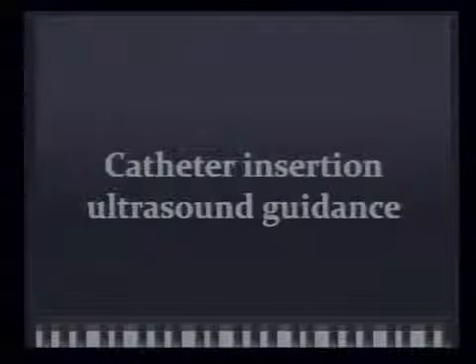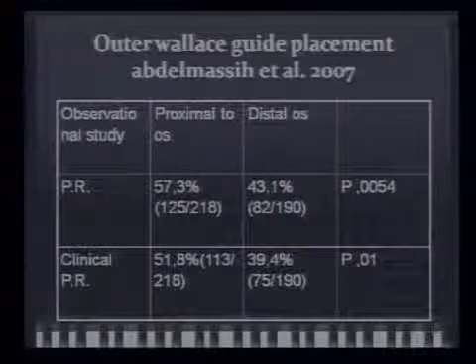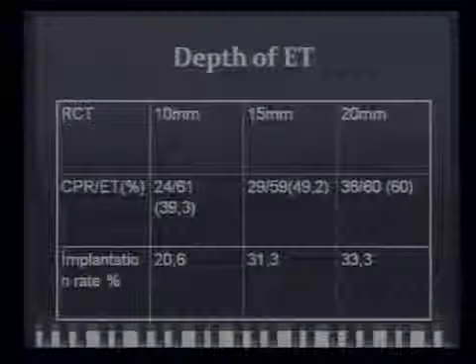What about the catheter insertion with ultrasound guidance? It has been discussed a lot. So as we know, ultrasound guidance positively affects the embryo transfer rates. Bladder filling and placement of embryos, those are the studies that were discussed previously.